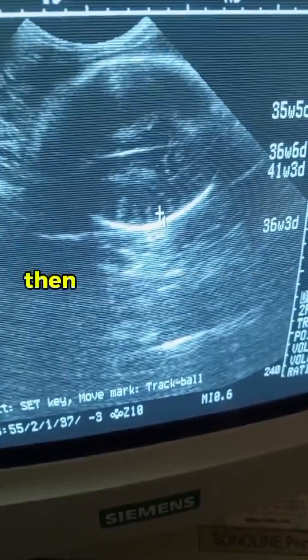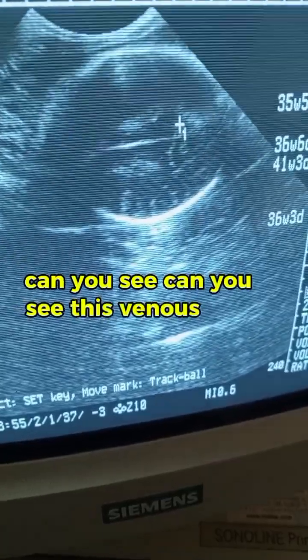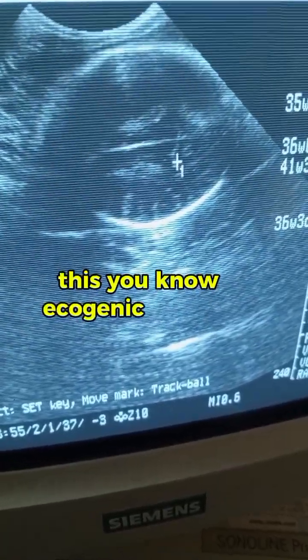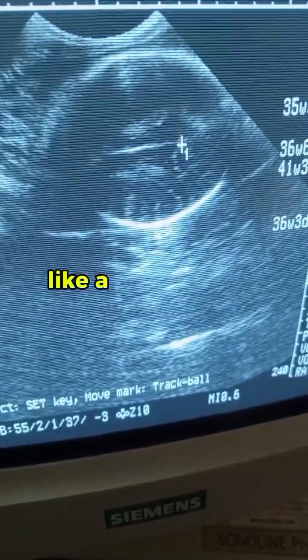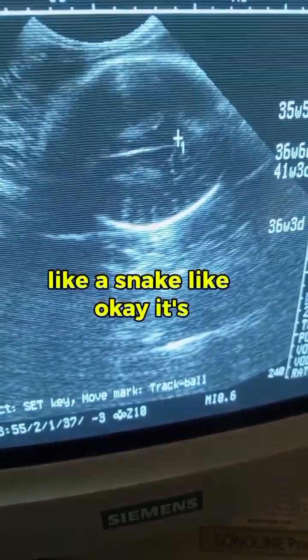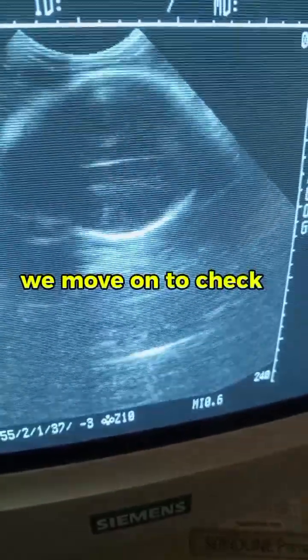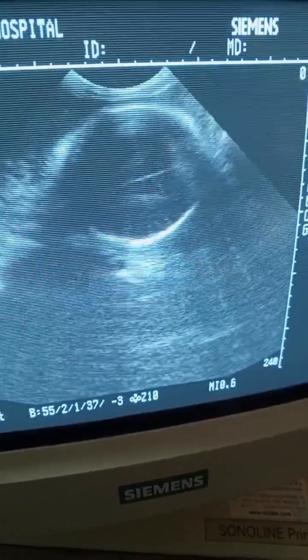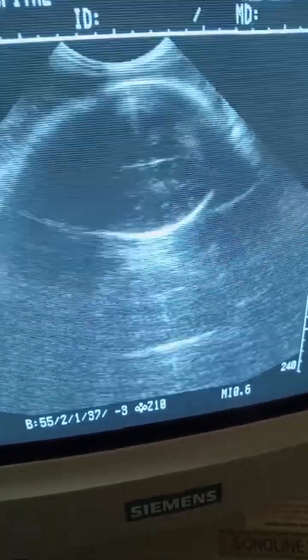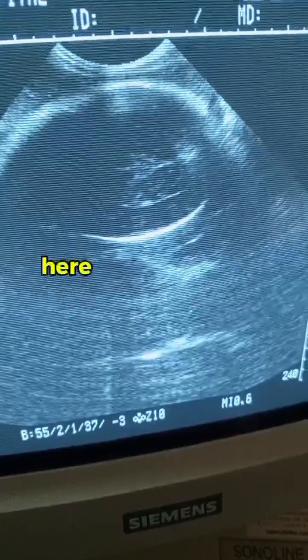So it's normal. Then from there, you see the vermis. Can you see this vermis here? This echogenic line, snake-like, is called the vermis. It shows that it's normal. We move on to check the cerebrum. Let's move. Okay, here we go again.